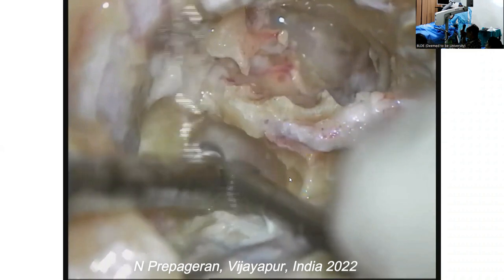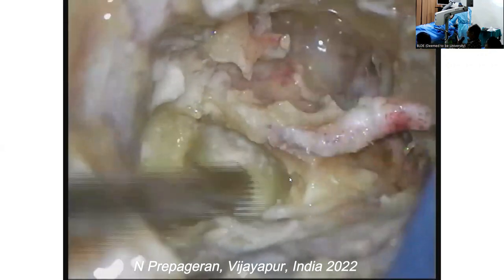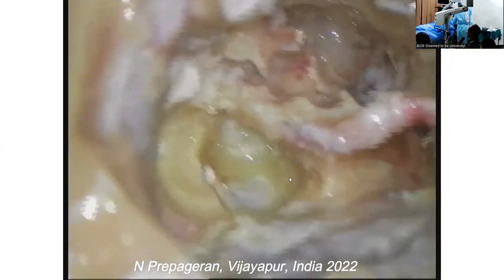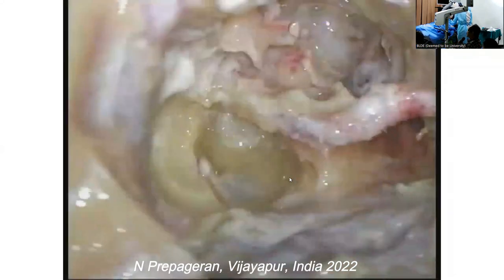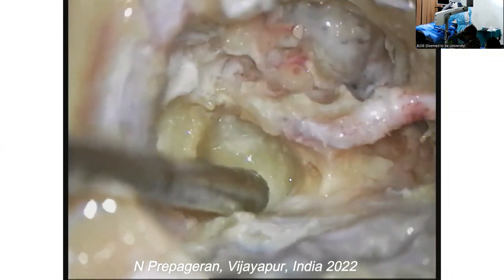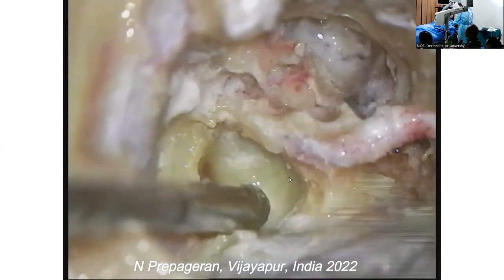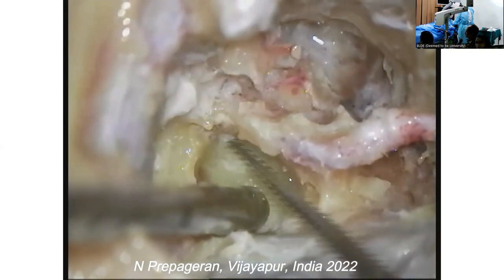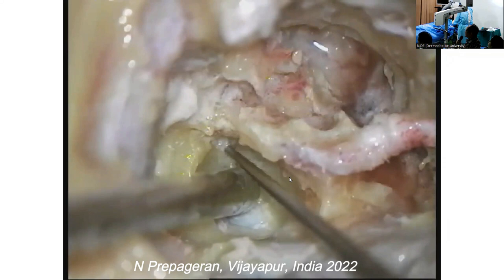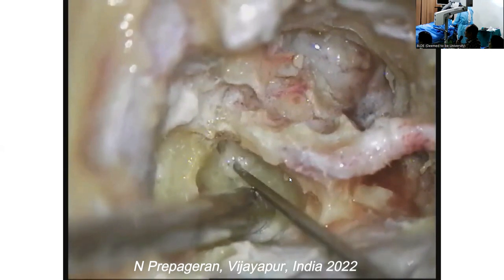So now I'm going to go above and underneath it. Okay, give me a pick. Okay, let's go higher, maybe. This one, right? Fine. So we're going to open up. That's the transverse crest there. That's your superior vestibular nerve. That's the superior vestibular nerve.